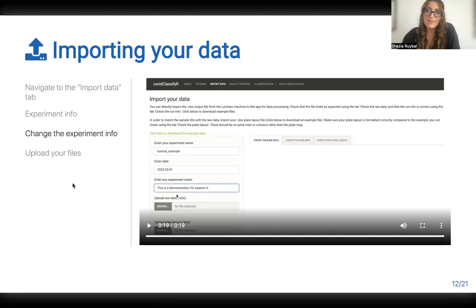Any questions at this stage or comments? Otherwise, the next step. Oh, yes. The time for the experiment is automatically captured on the report after the. Sorry, I can't hear that well. It's a bit far. The time of the experiment. Oh, yeah. Date and time. Yep, good idea in case you run more than one in a day. Excellent. Thanks for your suggestions.